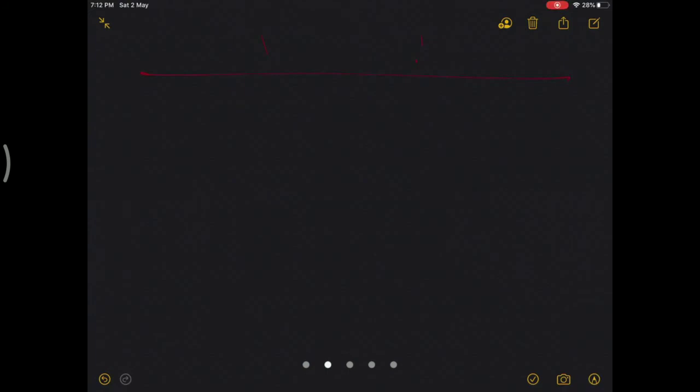Coming to gap balancing, it is a simple concept that you have to balance the extension gap equal to the flexion gap for the easy sliding of the articulation between the femur and the tibia.